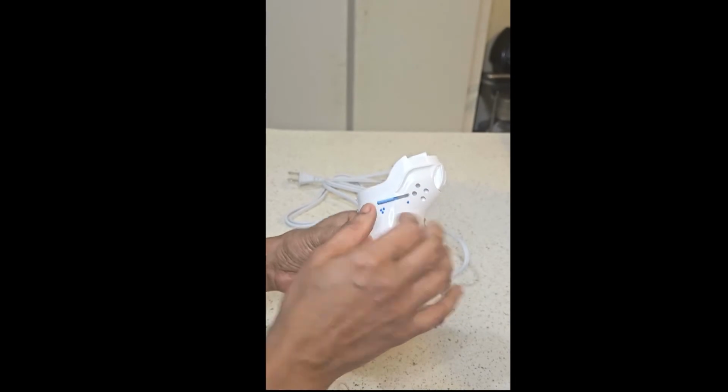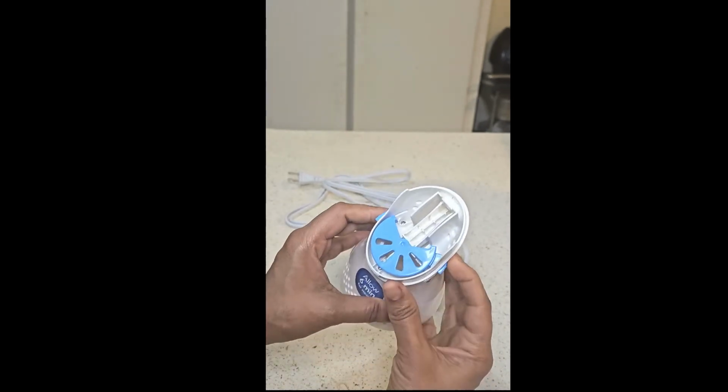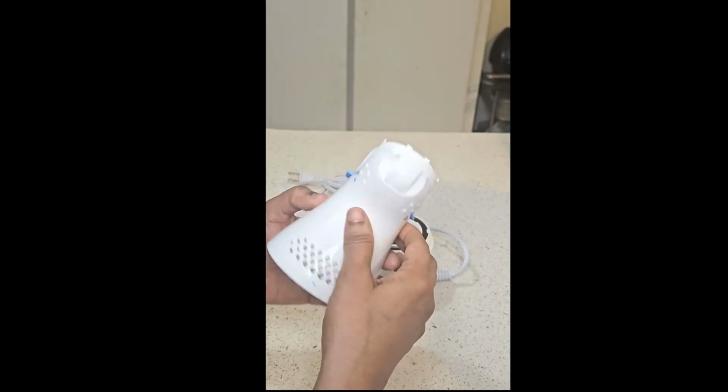Steam intensity. For more steam, move the steam disc control clockwise for maximum steam. For less steam, move the steam disc control counterclockwise for minimum steam. Steam inhaler will automatically shut off when water runs out.